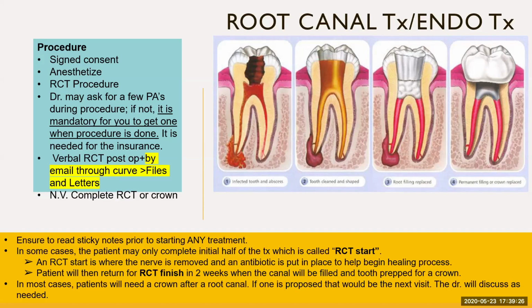It is also important that you verbally give post-op instructions to the patient and also email the same instructions to the patient. Next visit after an endodontic appointment could either be completion of RCT or crown. There are a few things that may be different between RCT appointments on patients. Always read the sticky notes prior to starting any treatment.